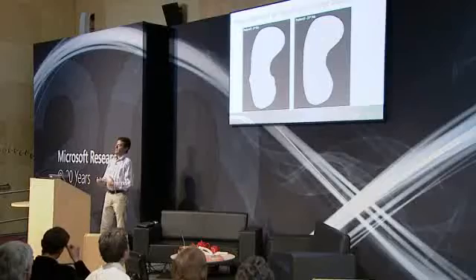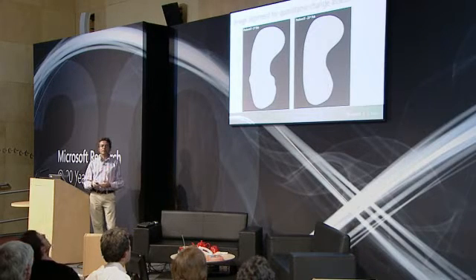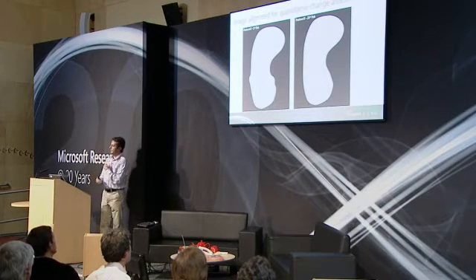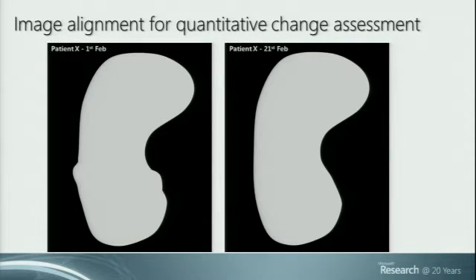So remaining in the same topic of quantifying, cancer patients get admitted to hospital maybe every week, every 2 weeks, and every time they go in there, a new CT scan or MR scan is acquired, and things change. The patient is in a slightly different position, or sometimes his intestines are full of food, or sometimes they're not. A lot of things change.